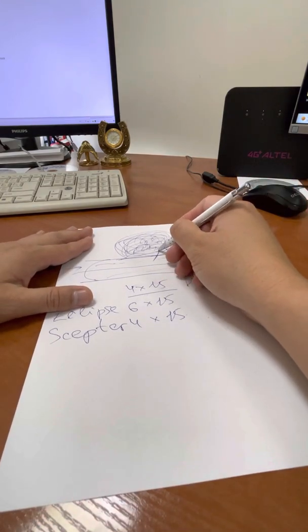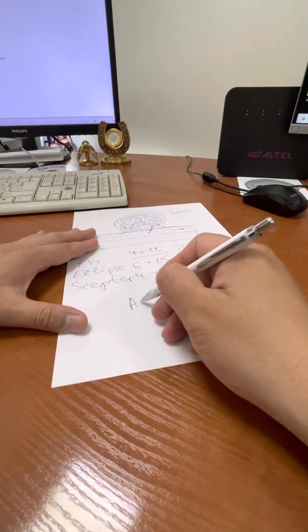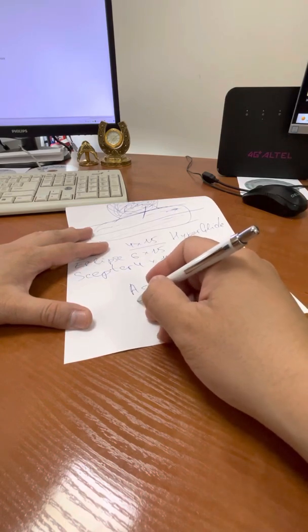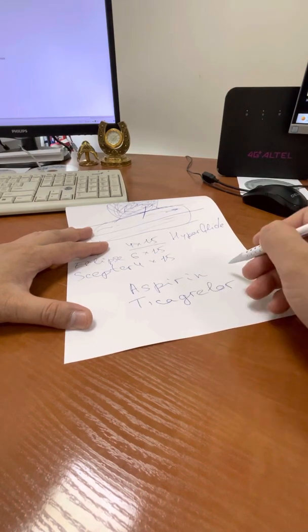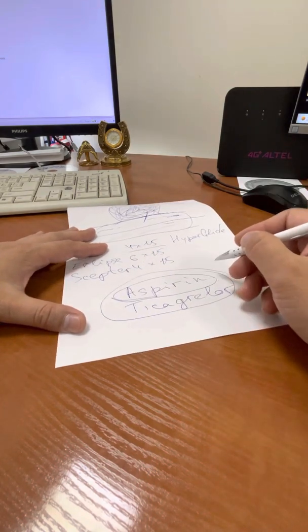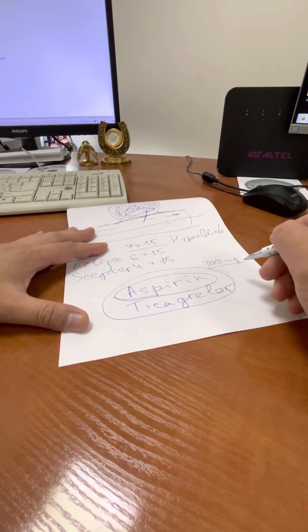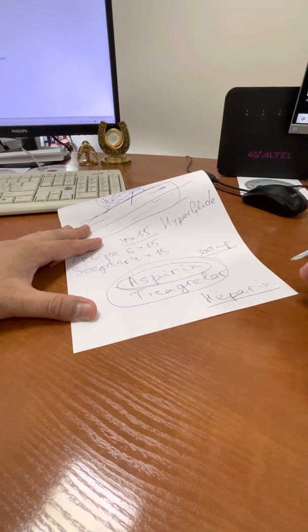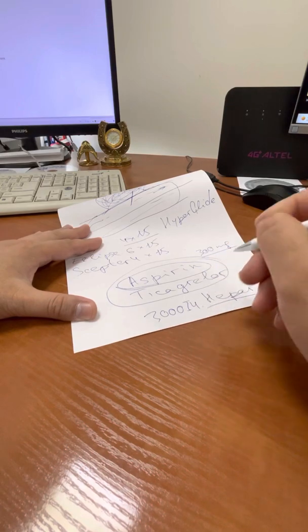If there is some protrusion, usually it's not a problem, because we prepare these patients with aspirin and clopidogrel, or nowadays more and more ticagrelor. All our planned patients take this medication. In acutely ruptured patients, aspirin, usually 300 milligram a couple of hours before the procedure, and heparin. Heparin all the time after the first coil, 3000 international units.